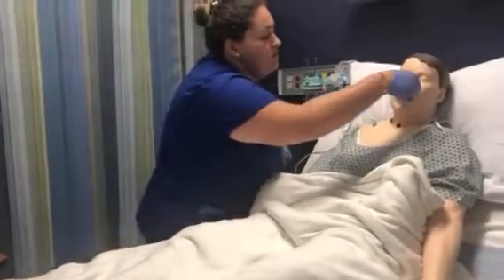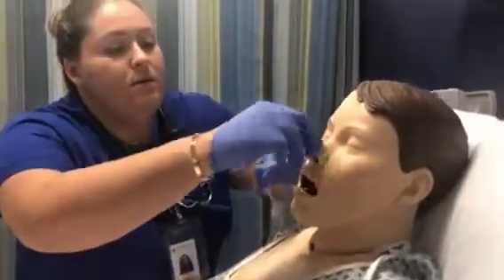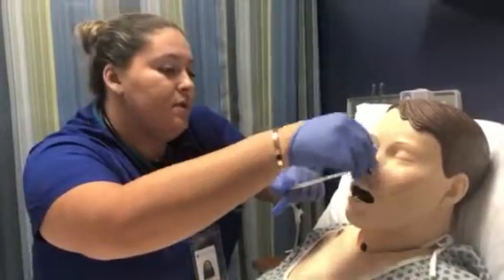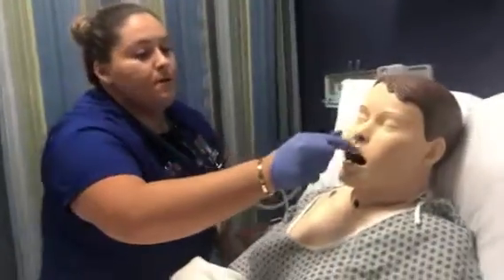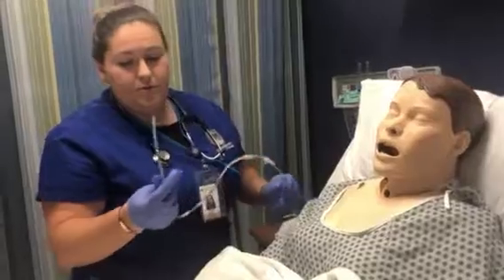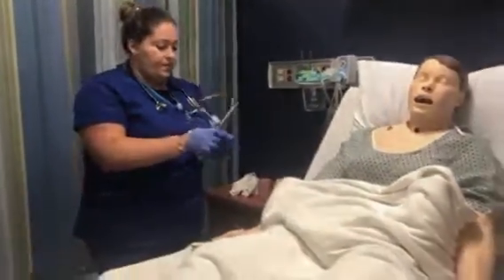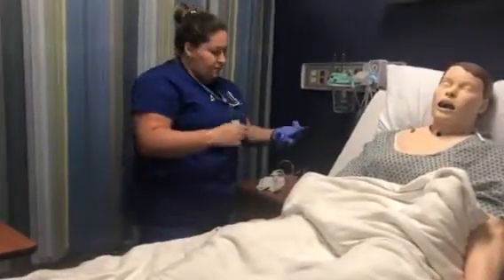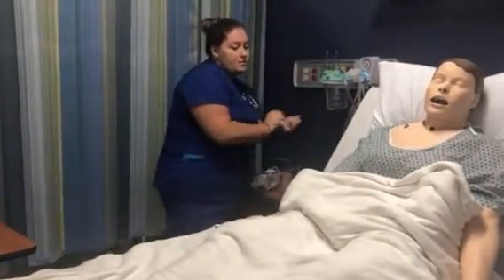Okay, going to remove the tape. Okay, just hold your breath, please. All right. Okay, so the tube is intact. Everything seems okay. I'll discard of this. I'll remove my gloves. Perform hand hygiene.